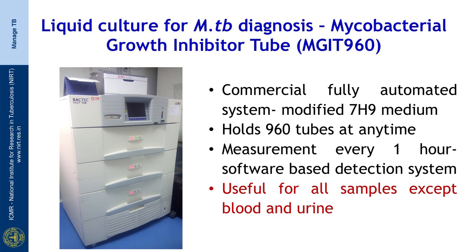MGIT is useful for all types of samples except blood and urine. Let us now take a look at the preparation of the MGIT tubes for inoculation.